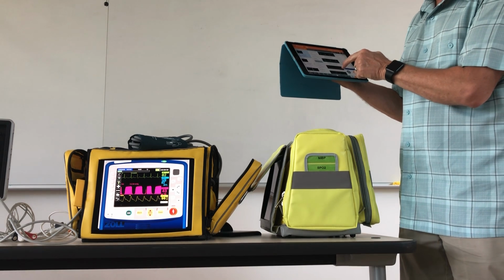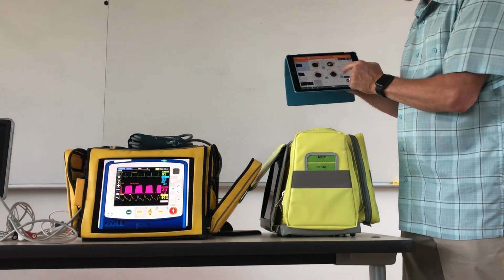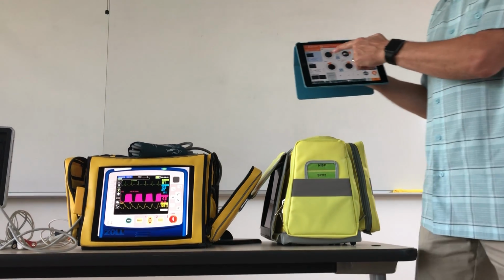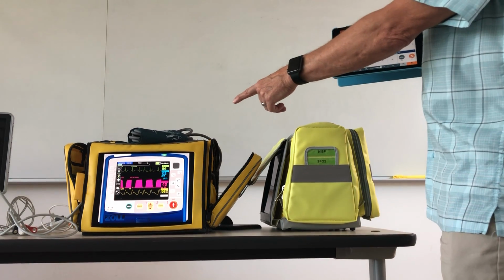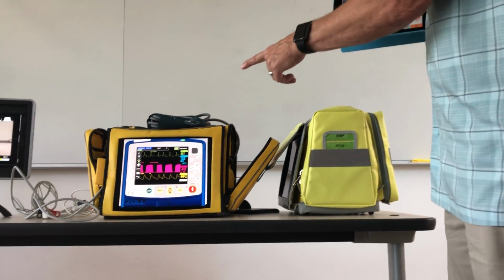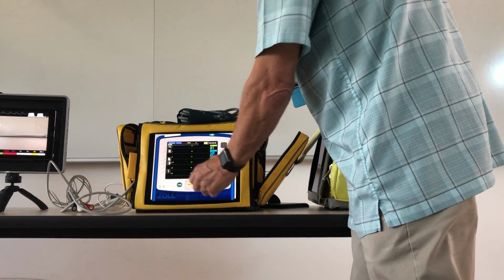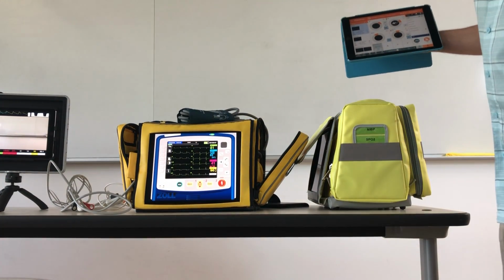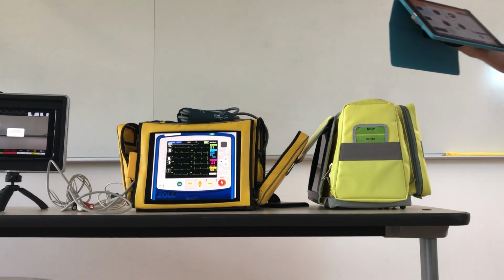So if I pick one of these, bless you. So if I pick the inferior STEMI, I'm going to send that there. So I can get an inferior STEMI, and if right now I decide to do a 12 lead on my Zoll, it'll jump into the 12 lead view, and I see that inferior evidence in all the appropriate leads where it should be.